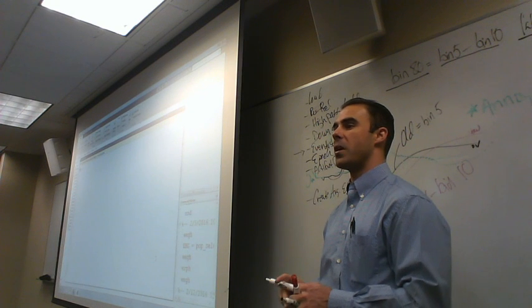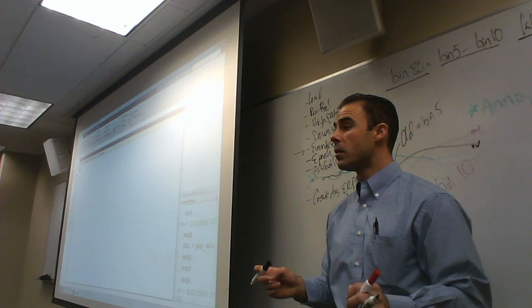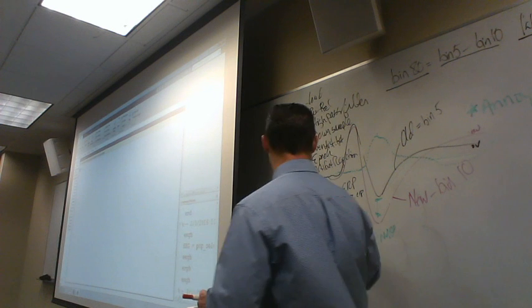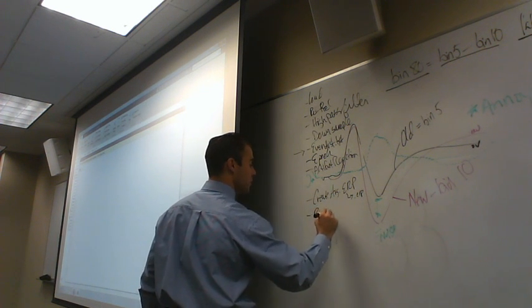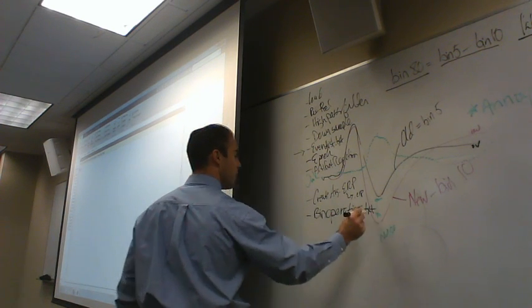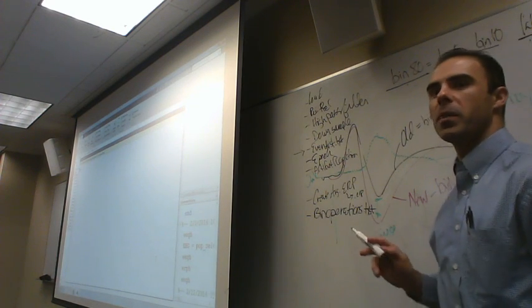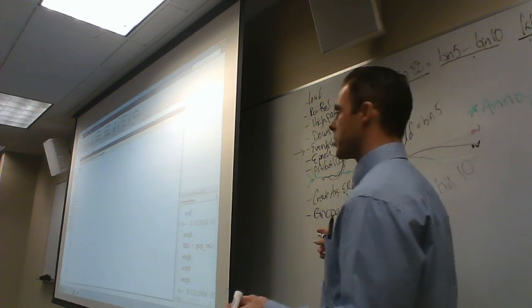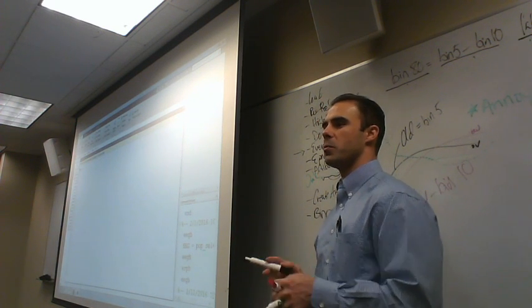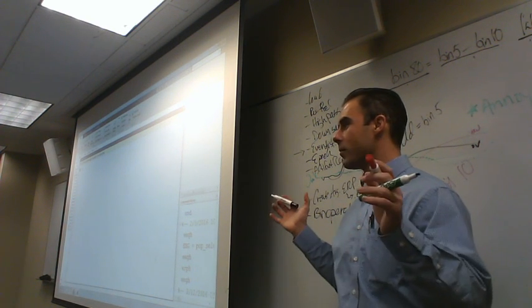Now, what did we do now that we have an ERP file as opposed to our EEG file? Yes, now we're back to that last part of our first question, bin operations. So now we apply our bin operations file, .txt, which is a text file, which is exactly what we explained with that example there. Okay, so structurally to the first question, you're going to apply the events list first before you would apply bin operations. And if you try to do it reverse, the computer's going to try to throw up on you and give you some ugly red error codes saying, we can't do this.